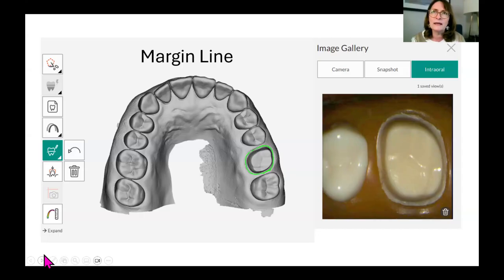It's almost like, I'm old, but back in the day, there were prosthodontists and dentists that would have the lab pour the models and send the model back to the office because the doctor wanted to trim and ditch the dies. And people really don't do that anymore. In my mind, that's what it is digitally, a doctor ditching and trimming their own dies.